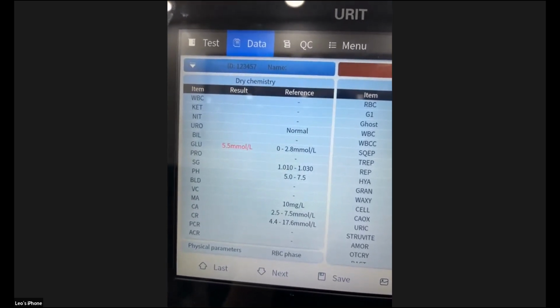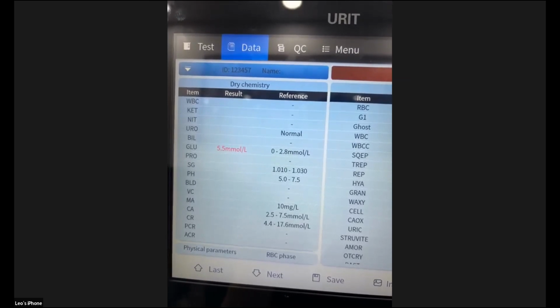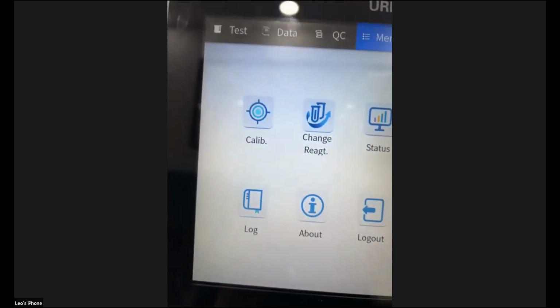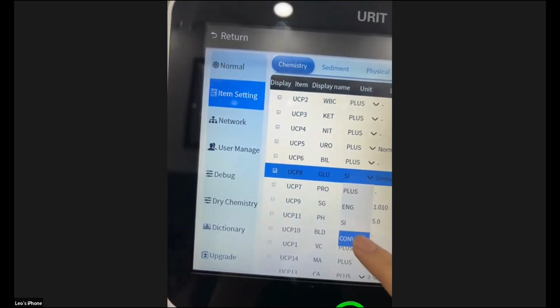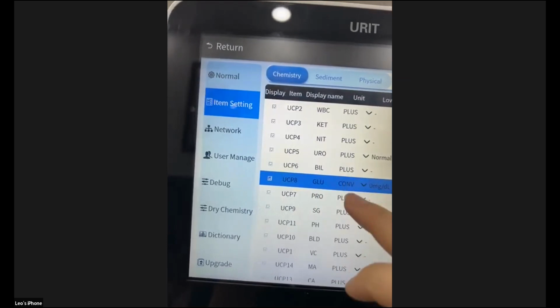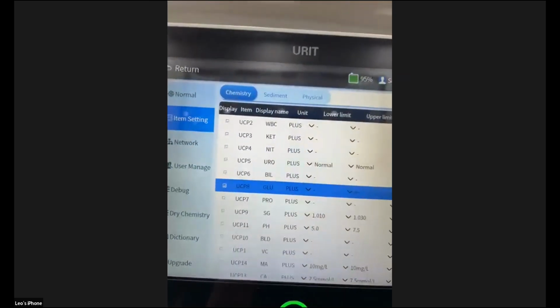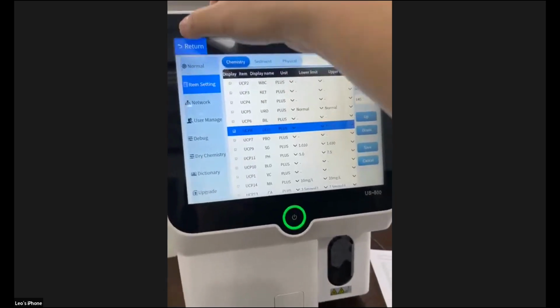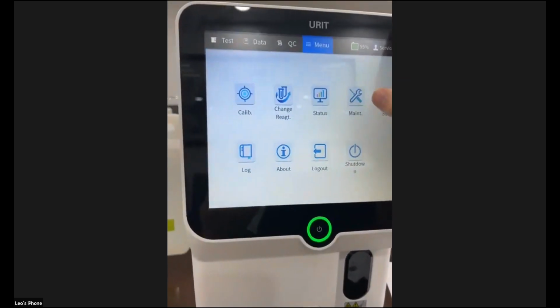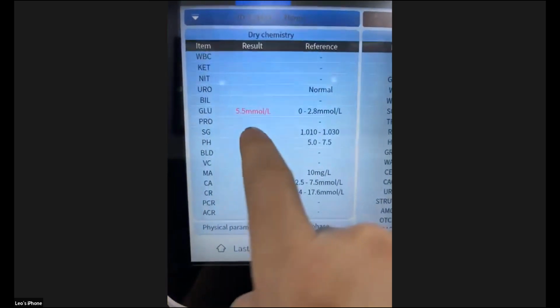Actually, some customers ask for that when we print 1+ or 2+, maybe some plus-minus, then they ask us, what do you mean by 1+? Because every time they will not see the label on the bottle, so they want the actual number. So okay, that will solve the problem.